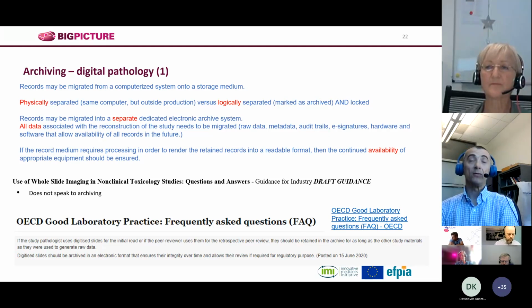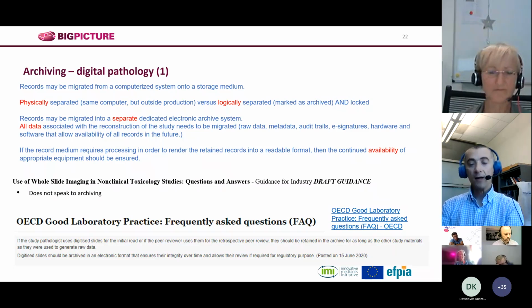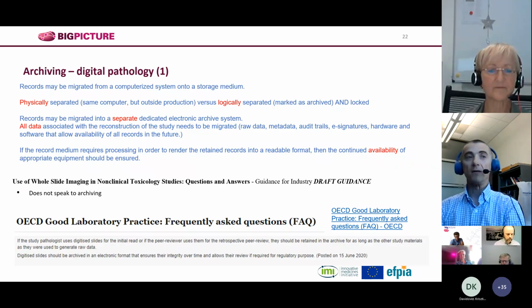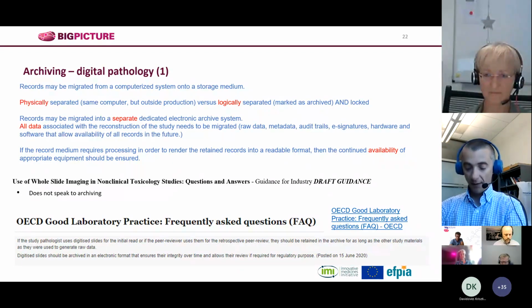Do the regulators expect that the servers will be on site, on premise, so that the day of the inspection, they can open the door, they can check security, who has access and whatever? Or is it acceptable that the servers are not on site and not necessarily directly amenable to a physical inspection? And so this remains to be clarified.